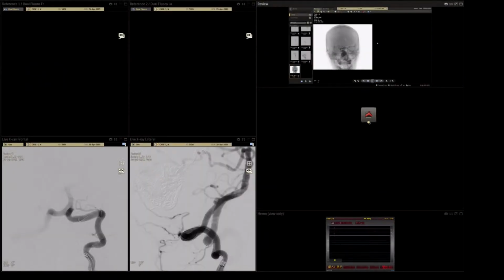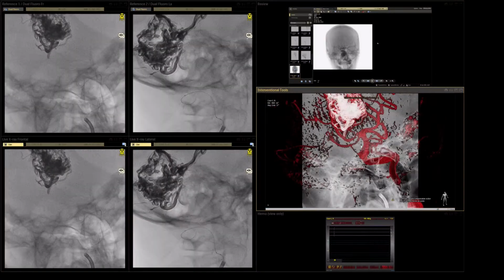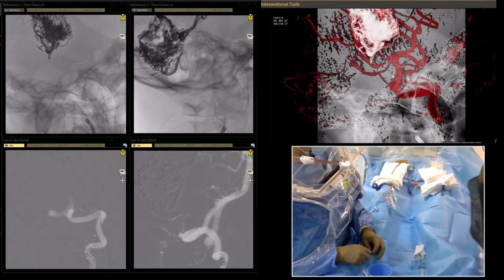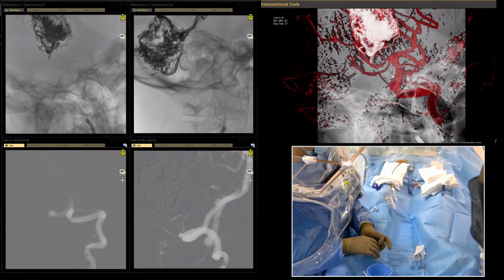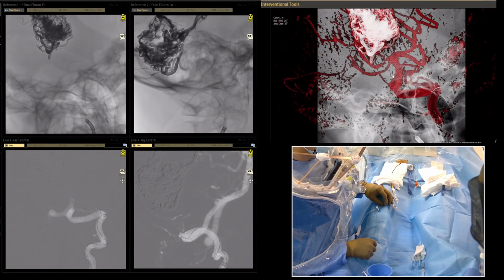Then we need to replace it here. If you don't want to go there, it's already there. But if you want to go to different places, yes.